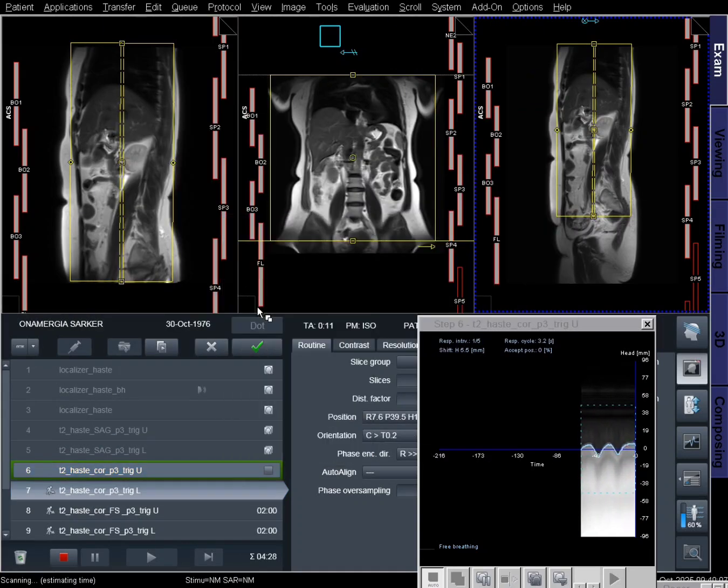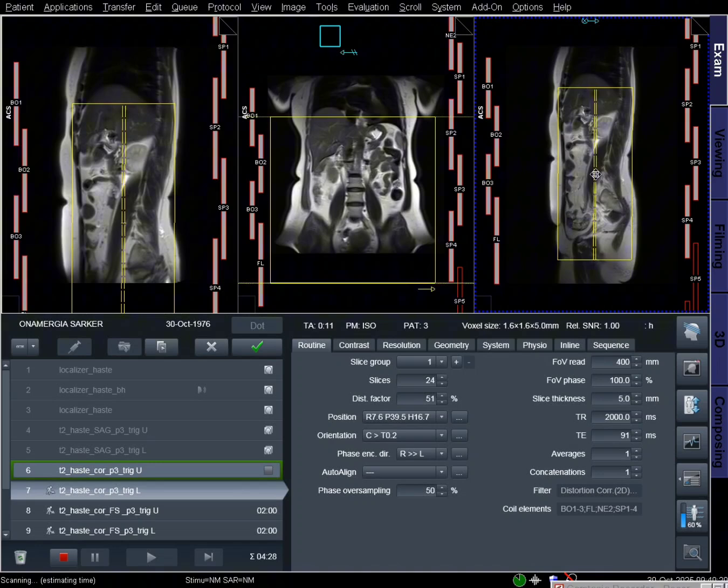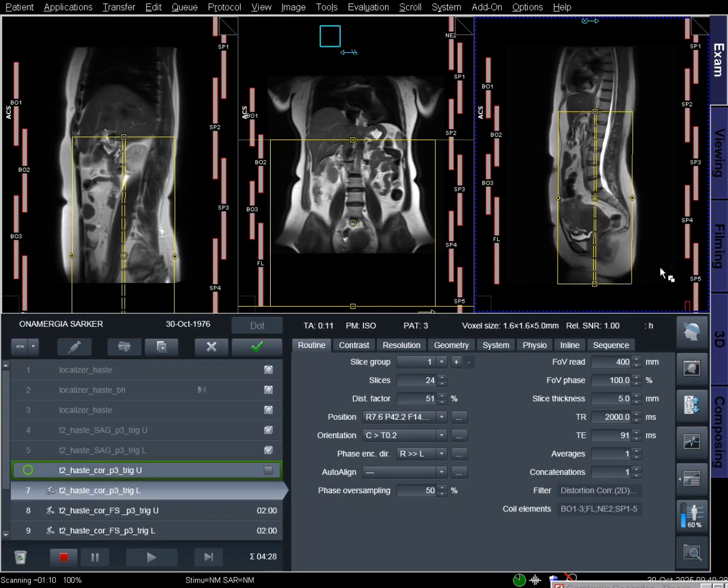both structure and function. MRI abdomen is typically performed for evaluation of hepatic lesions, liver cirrhosis or fatty liver, assessment of pancreatitis, pancreatic masses or biliary obstruction, detection of renal masses, cysts, or vascular abnormalities, and for investigating unexplained abdominal pain. During the procedure, the patient lies inside an MRI gantry, a tunnel-shaped scanner.